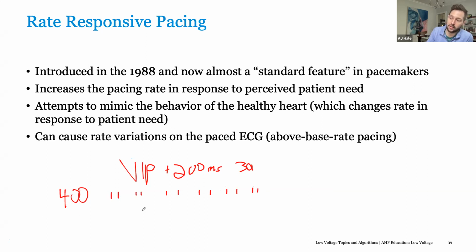And then if nothing occurs, it always paces, and then it re-shortens the AV delay to be short again. So that means that most of the time you have this AV synchrony. You get that extra 20 to 30% of your cardiac output. And if they are conducting, say an intrinsic event did occur right here, it would then leave the AV delay at 400 milliseconds. So at times when they are conducting, we're allowing them to break through, so we reduce our RV pacing.